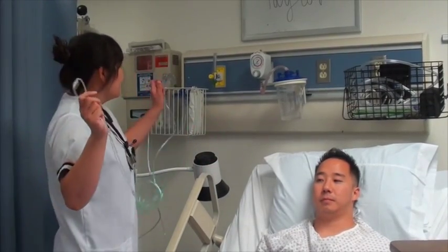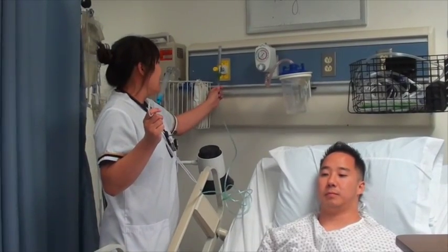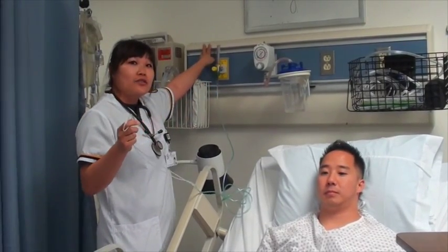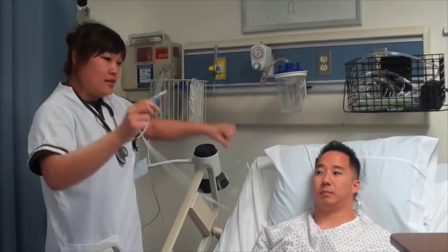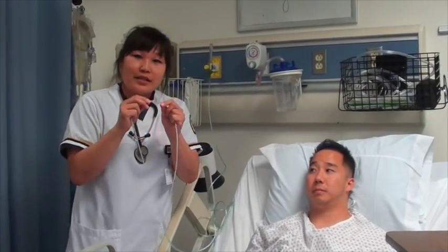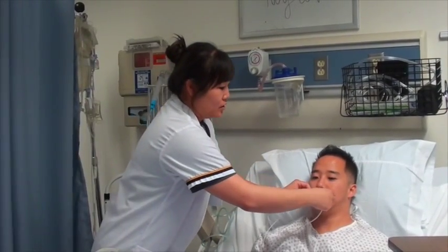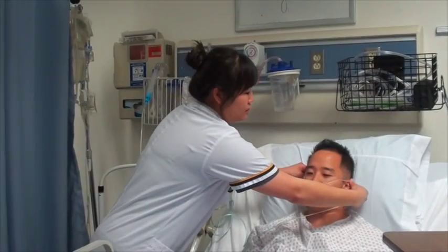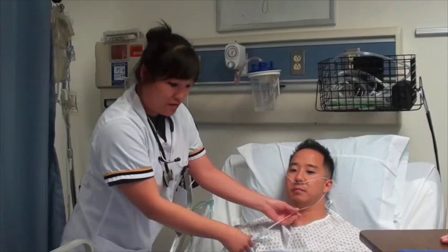The tubing is connected to a flow meter, and the flow meter is connected to an oxygen delivery, and the nasal prongs are actually the ones that deliver the oxygen. It is inserted into the nares, goes around the ears, and is secured under the chin.